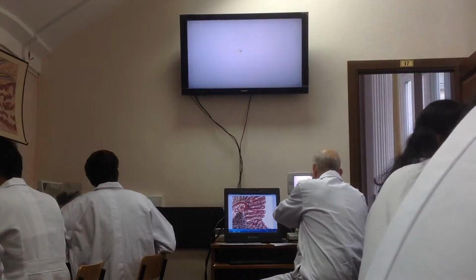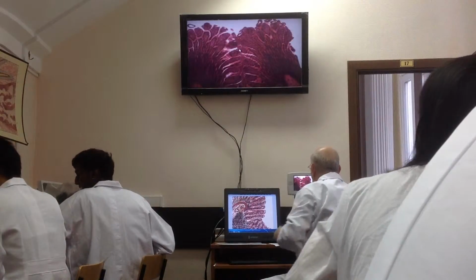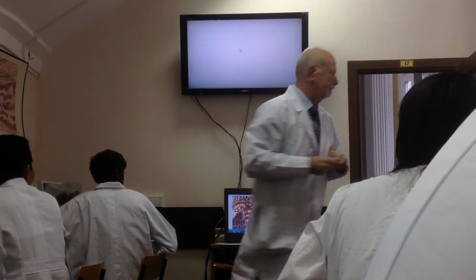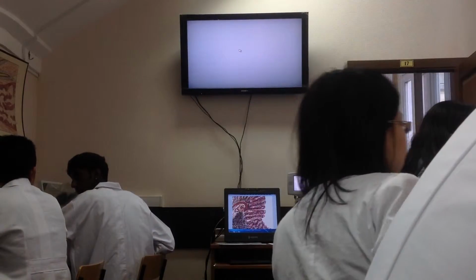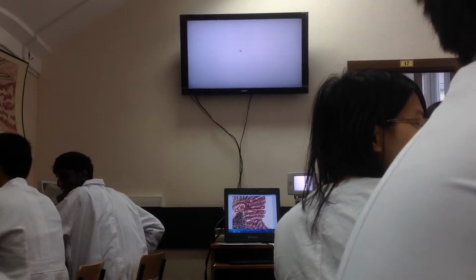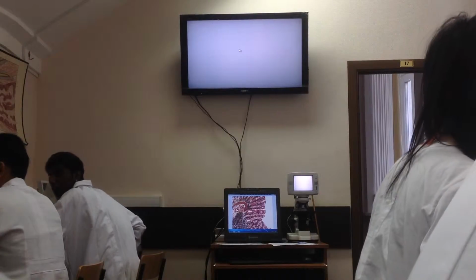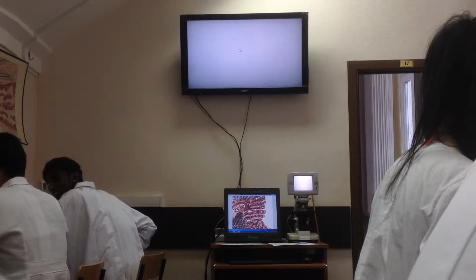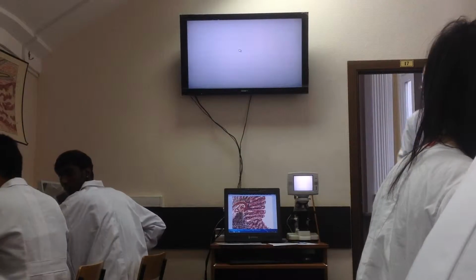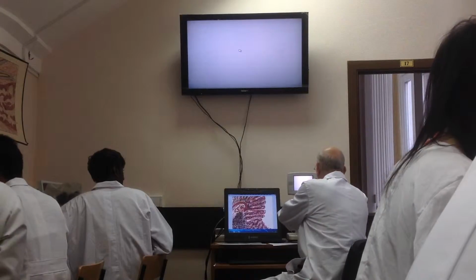Now, look at this slide. Sorry. Now look at this slide.